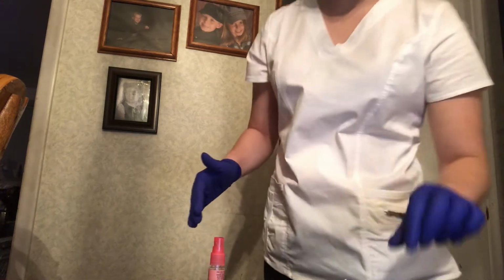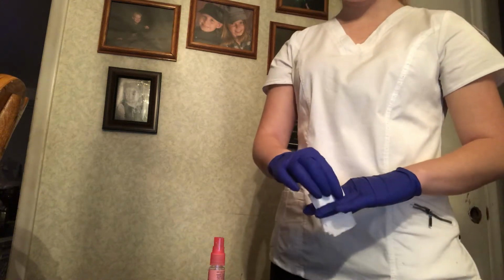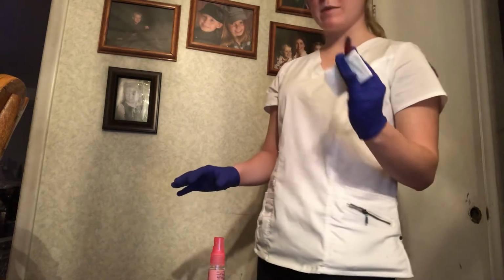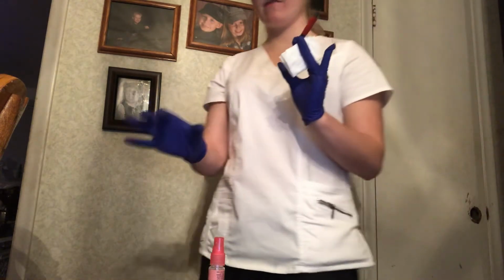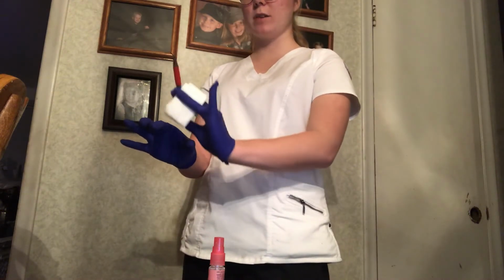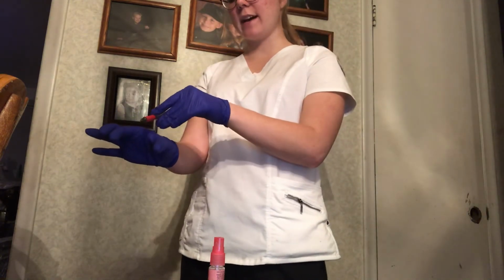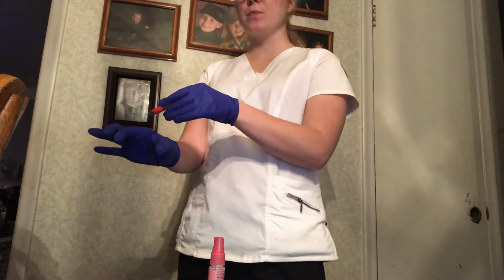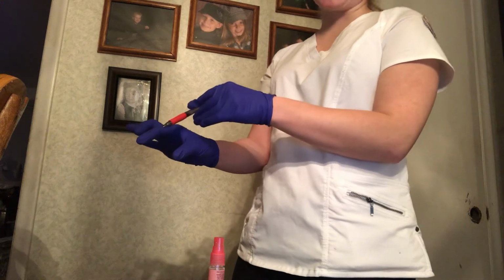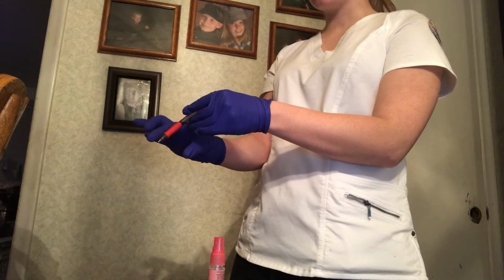Okay, great. So now I'm going to grab gauze between my 3rd and 4th fingers and grab the insulin, decapping it to not contaminate it. I'm going to grab the fat with my non-dominant hand, and then clean with the alcohol swab and dispose of that in the correct location. Now I'm going to insert the needle at a 90-degree angle, squeezing up some fat. Because the patient has some extra fat on them, that's why it's a 90-degree angle.